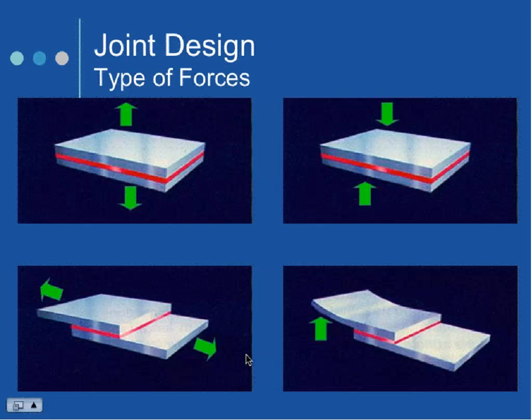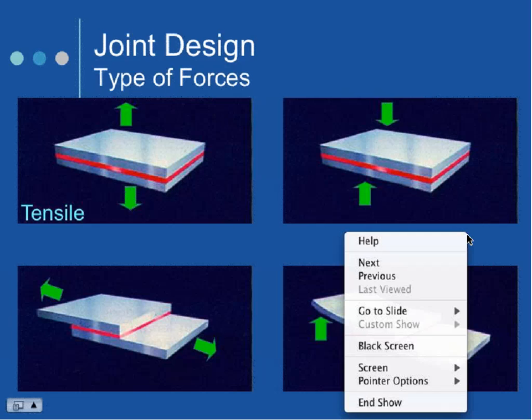So let's look at the first one and just get some quick definitions out of the way. When we talk about tensile forces, we're talking about two lap shears, one on top of the other, pulling in opposite directions. So they have a tendency to elongate or stretch the object or the medical device. Tensile forces are fairly compatible with all adhesives. Most adhesives can withstand them quite nicely. The opposite of that would be a compressive force.